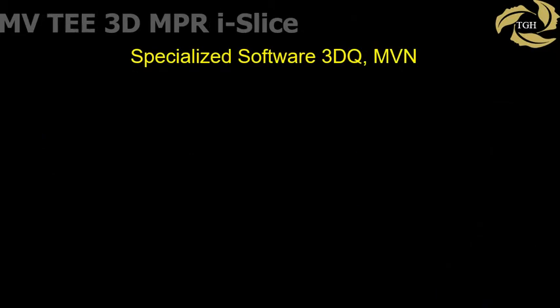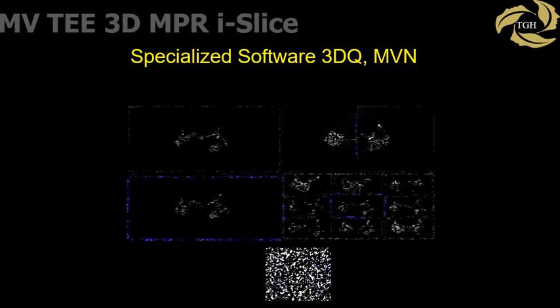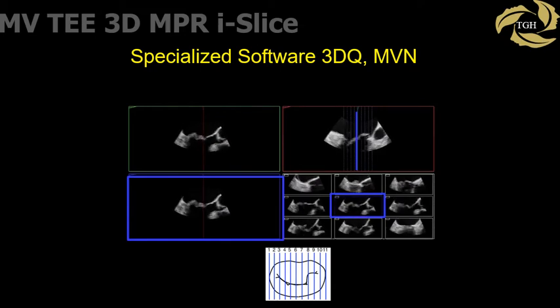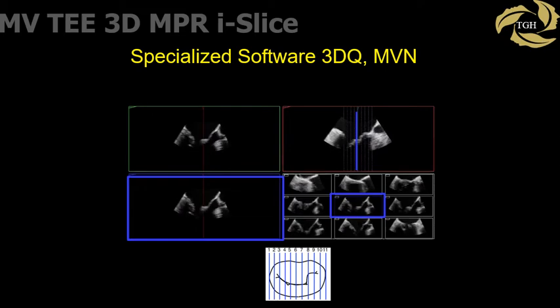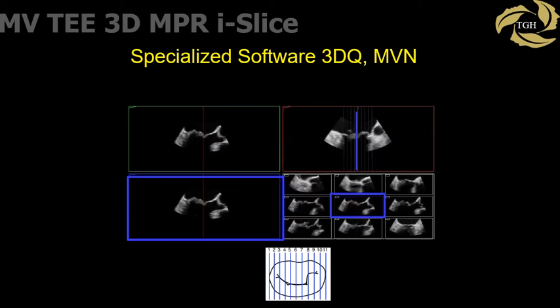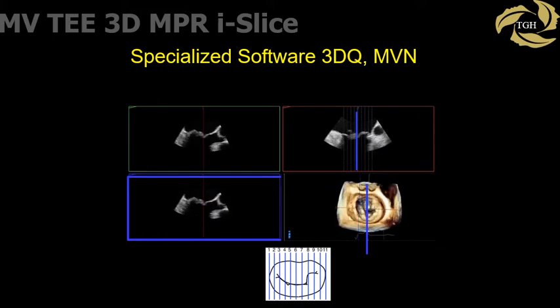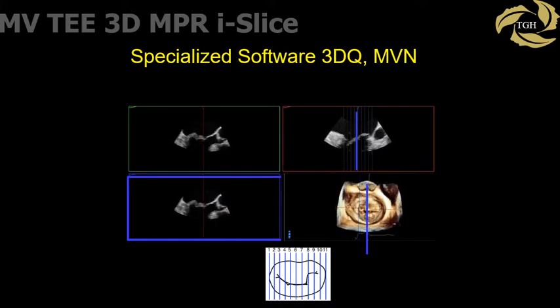Another option using specialized software permits aligning predefined cuts perpendicular through the mitral valve, similar to CT scan cuts. This results in a display of multiple sagittal cuts through the mitral valve, each of which can be examined for pathology. Using iSlice, the on-face 3D dataset can be displayed on screen to localize individual segments. Remember, the pathology is identified using these 2D cuts extracted from the 3D dataset.